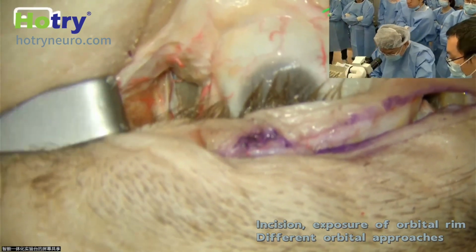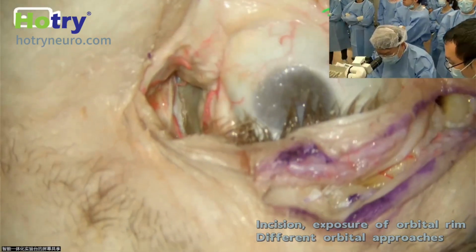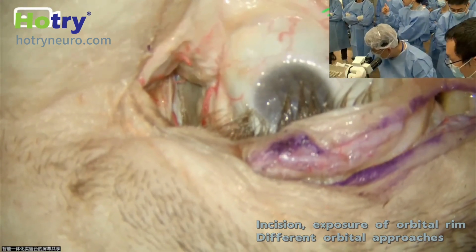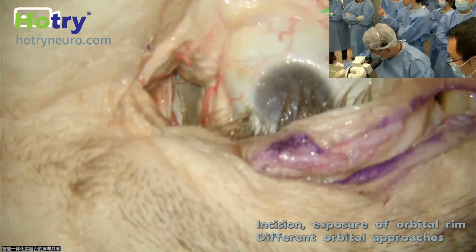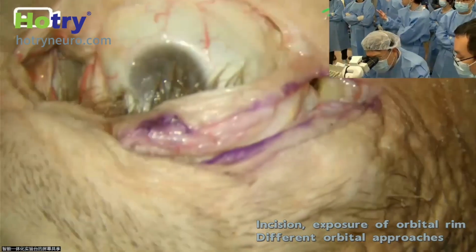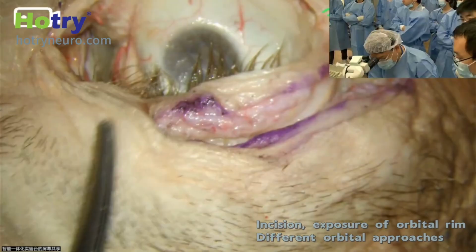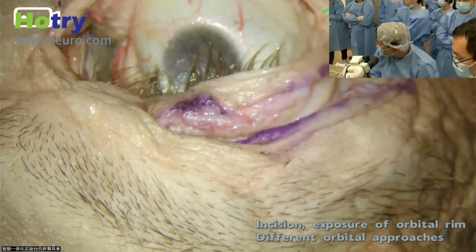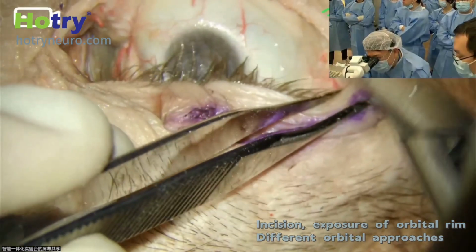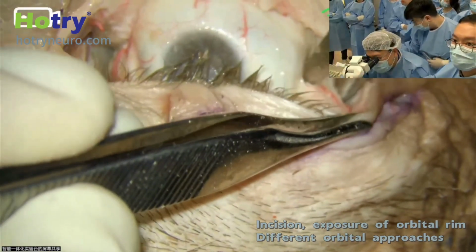Last but not least, let me demonstrate the reverse swing eyelid approach. Of the four approaches demonstrated, the reverse swing eyelid is particularly useful for superomedially located lesions. In fact, we did several cases. So basically, it's the same. We did the canthotomy, and now we do the superior cantholysis.